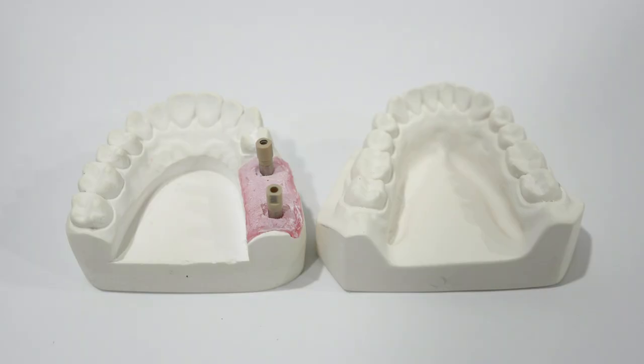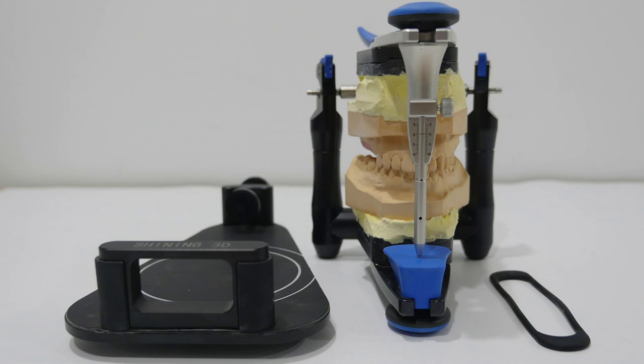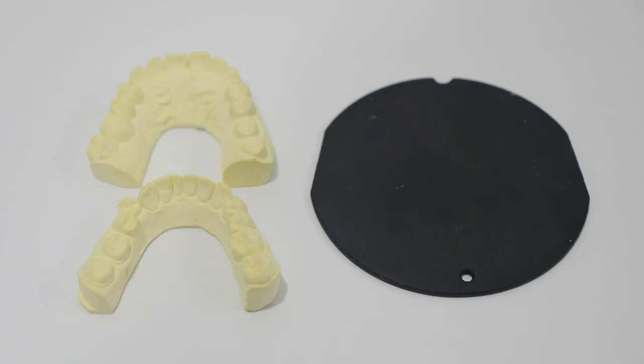The first demo is an implant case, scan body scan. The second demo is an implant case, abutment scan, and this case was mounted with an articulator. So I will directly scan the articulator, and at the end of the workflow, I will fill the screw channel in a digital way, then directly transfer the bite to XCAD and activate the function of the virtual articulator. The third case is a non-separated model, so I will scan this case with the all-in-one function.